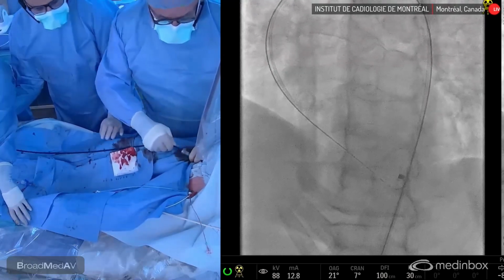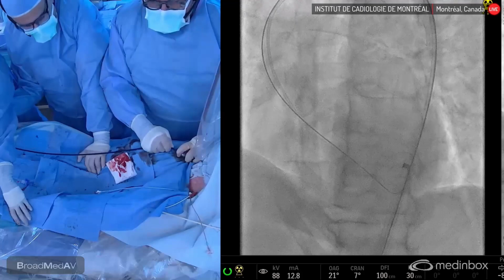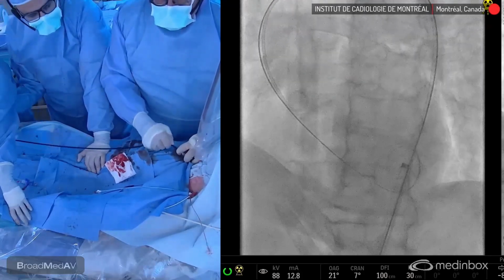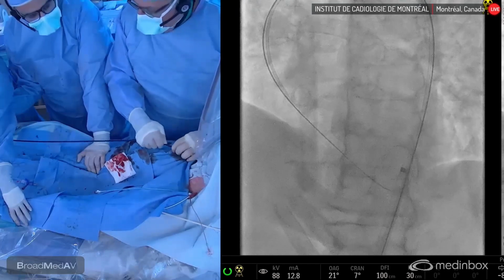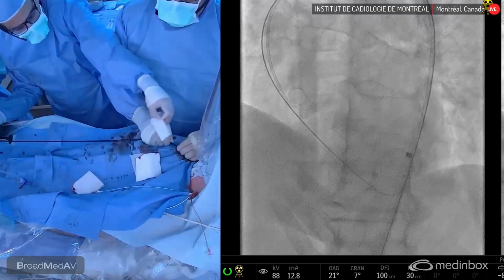So we're just talking about, you know, what's the best deployment. And so to the point that the coronary is a little bit low, as opposed to maybe a really high deployment, sort of 80-20 or 90-10, probably going to err a little bit more on a lower deployment, maybe more 50-50.